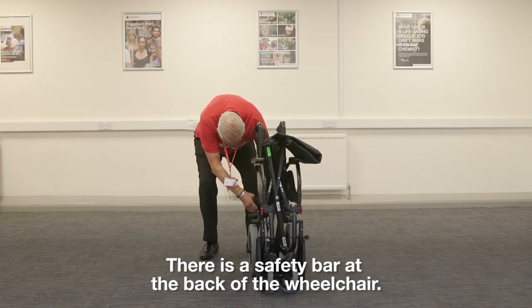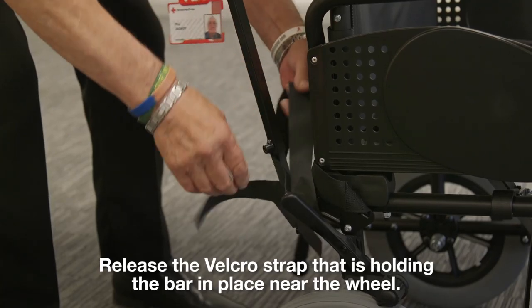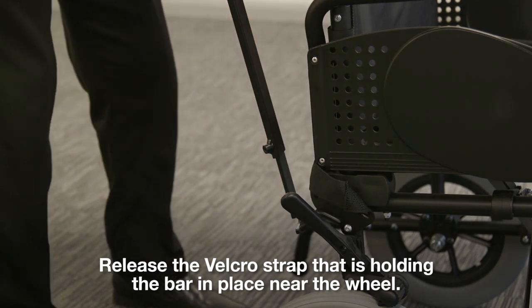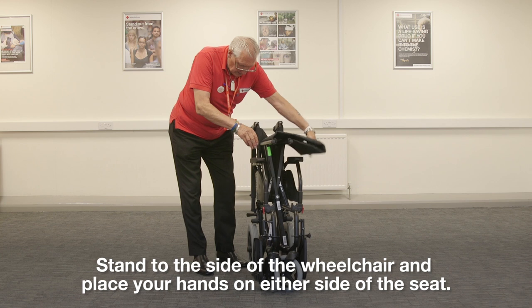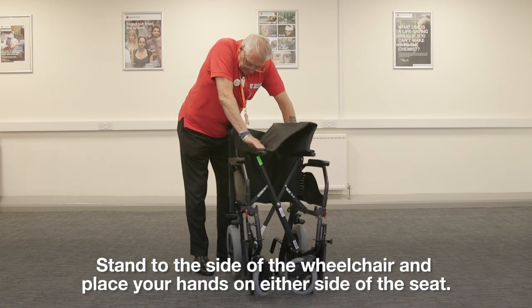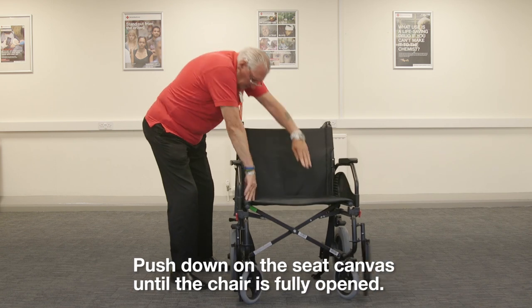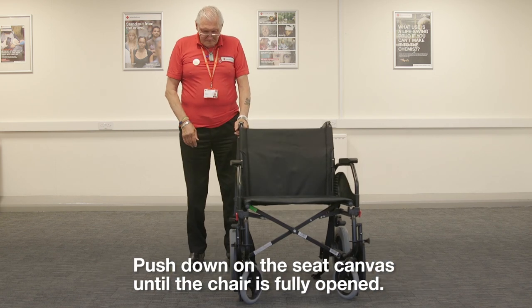Step 1: Opening your wheelchair. There is a safety bar at the back of the wheelchair. Release the velcro strap that is holding the bar in place near the wheel. To open the wheelchair, stand to the side of the chair and place your hands on either side of the seat. Push down on the seat canvas until the chair is fully opened.